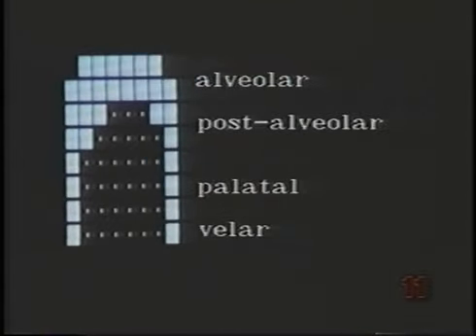Note that the computer display shows a symmetrical arrangement of the electrodes. In actual fact, the front 4 rows, as seen earlier, are concentrated in the anterior parts of the palate. The rows of electrodes can be related to the place of articulation labels commonly used in phonetics.